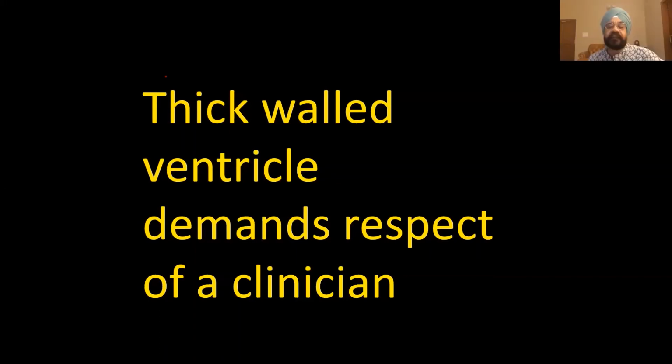So now the question from Dr. Rohit Kandan: asymptomatic hypertrophic cardiomyopathy versus severe cardiomyopathy. Are there differences on echo? I could not get much of the question. Asymptomatic hypertrophic cardiomyopathy versus severely symptomatic hypertrophic cardiomyopathy. I think they want to know, is there any symptom and echo correlation? Are there any findings on echo which suggest symptoms?